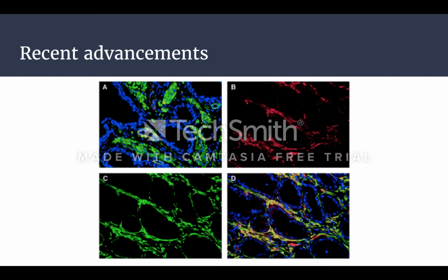Recent advancements in immunohistochemistry include the ability to better differentiate between tumor types and the use of biomarker detection in clinical practice. Studies and experiments have been performed using IHC in order to detect presence, morphologies, and genetic characteristics of different tumors. Protein expression through IHC testing is critical in monitoring the progression of cancer and helps with treatment. These advancements help lead to more personalized treatment in diseases and cancers.